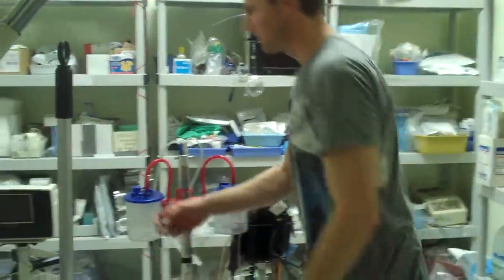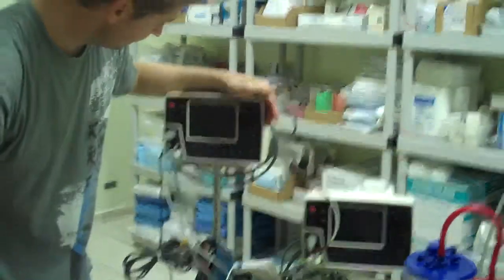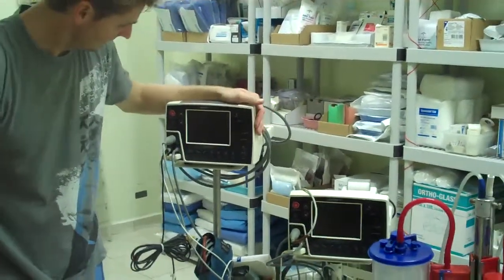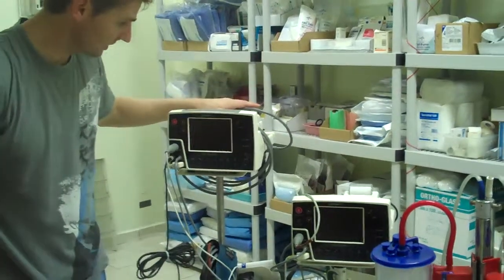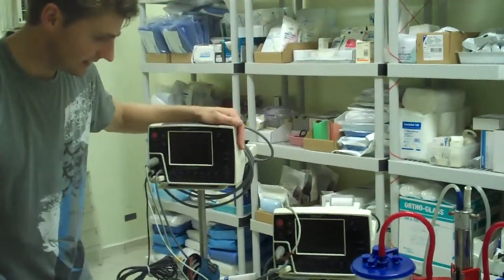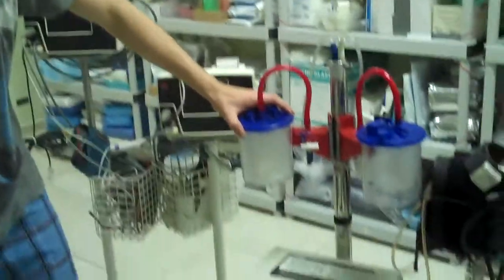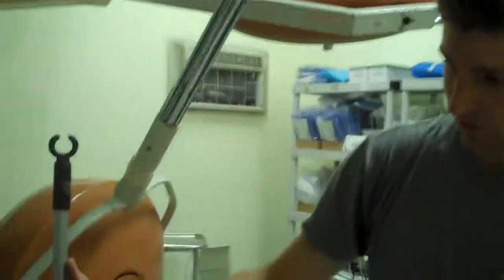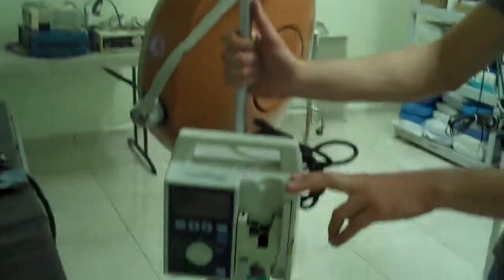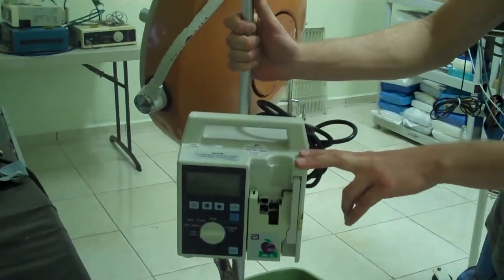If that fails, we have two GE Scholar III monitors. They have working pulse oximetry and non-invasive blood pressure, however EKG does not work on either machine. We also have good working suction machines, as well as a pump for running IV solutions at set rates if desired.